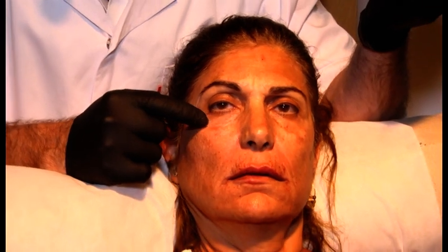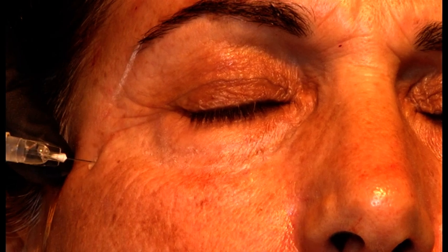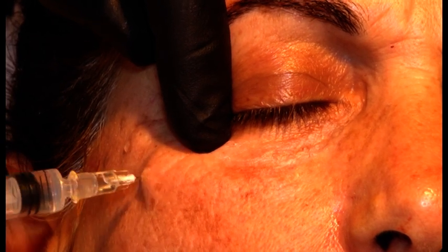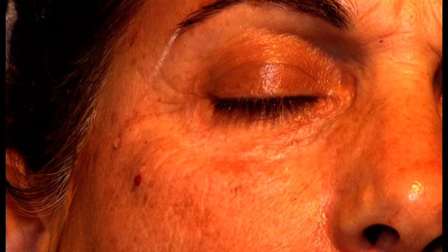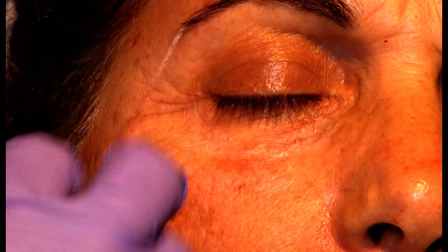If you inject a little bit of Belotero Intense over here, and you know what? I think she's really tired of me, so I'll numb her a little bit. I'll give her a little bit of anesthesia. 1, 2, 3. For the entry point, and then there's a nerve here, the zygomaticofacial nerve. Okay. 0.25, yeah, that should be fine. Cannula, please. Needle.